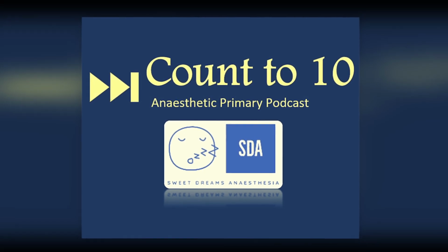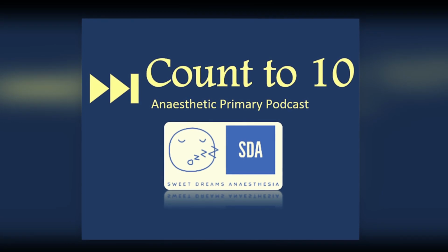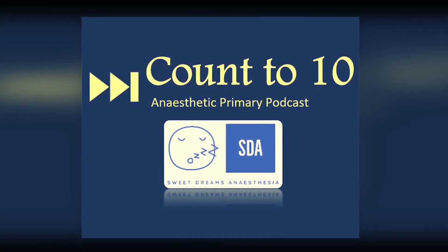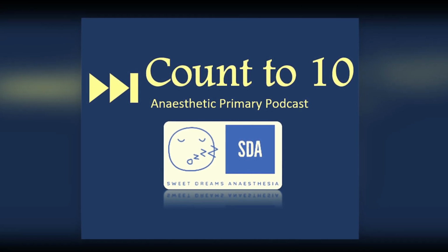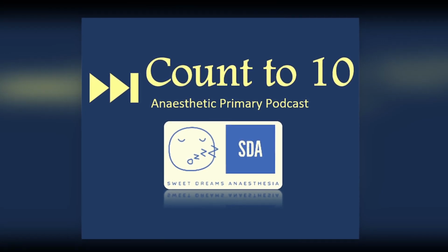Now, you do have to know some R values and what they correlate to in terms of saturations. The most important is the R value of 0.4 correlates to 100%, an R value of 1 is 85%, and an R value of 3.4 is 0% oxygen saturations.